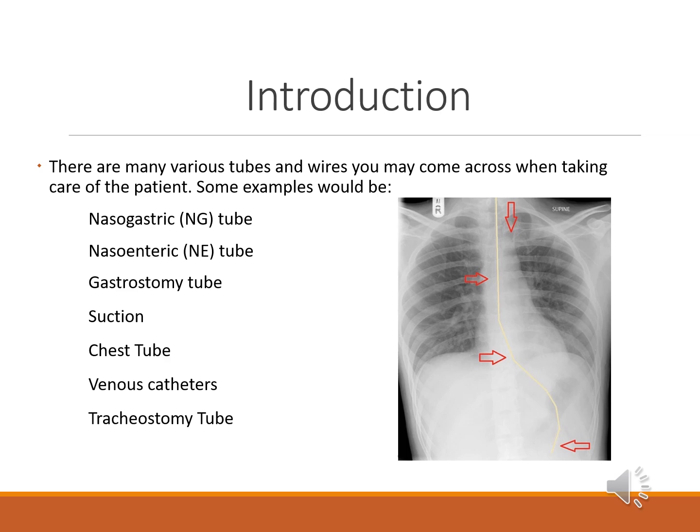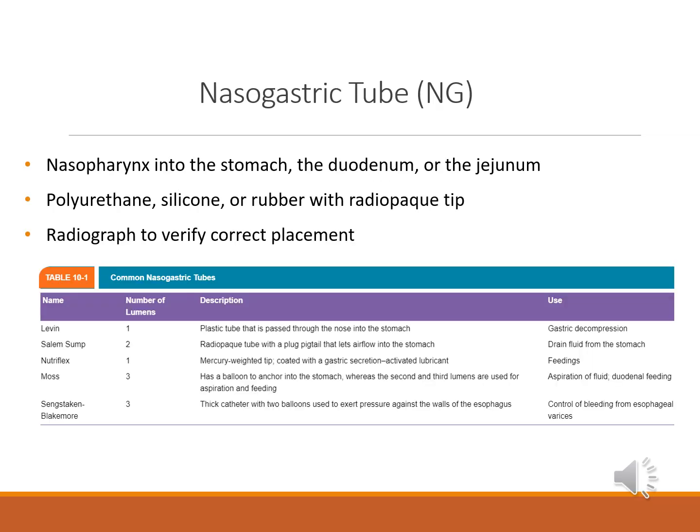Chest tubes are used after surgeries, injuries, or lung disease to drain fluid or air from the pleural space. If air or fluid builds up and isn't drained, it can cause tension pneumothorax, which is a serious condition that needs immediate attention. After surgery, various types of patients may also have drains that will be placed to manage fluid accumulation. Radiographers should be able to identify these drains and handle a patient with care to prevent them from becoming dislodged during imaging.